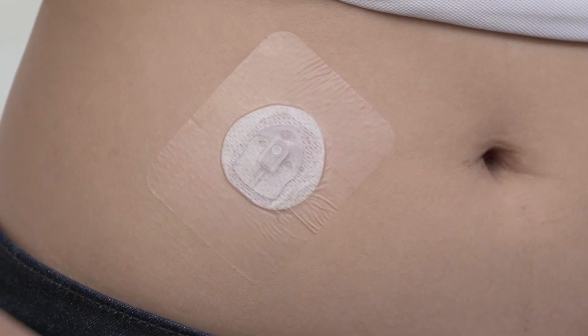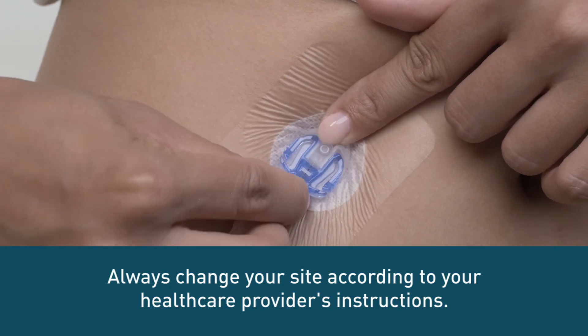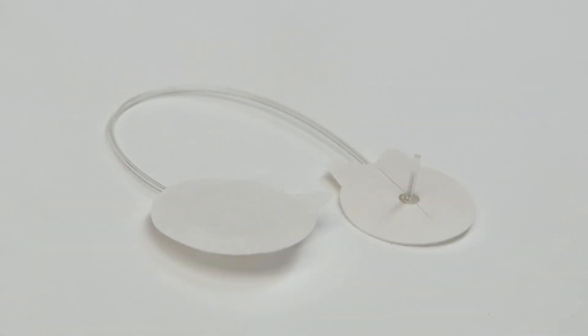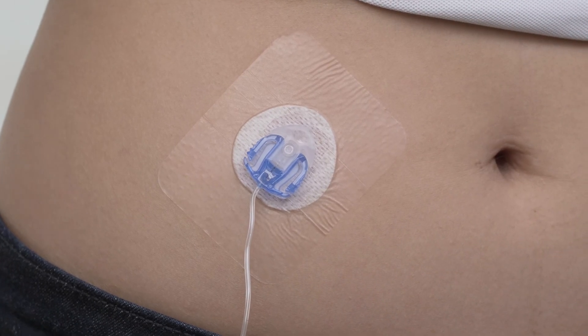No matter what set you use, it's important to change it according to your health care provider's instructions. Typically, this is at least every three days for soft cannulas and two days for steel sets. Exceeding these times increases your risk for tissue damage, scarring, infection, and high blood sugar.